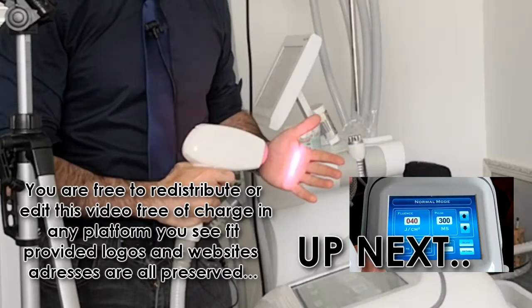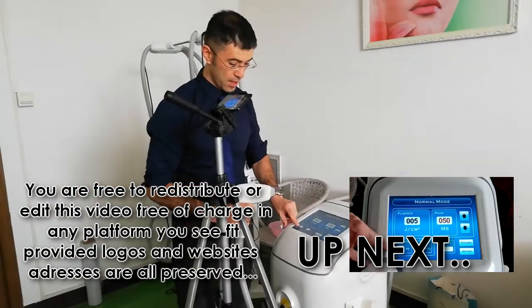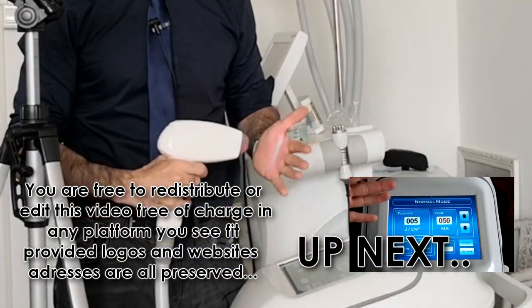At this distance I can feel it. If I go, I cannot dare go even closer because it's really, really powerful. This is why it's only allowing 8 pulses a second. We're going to just try it right now just to show you. And you can see the pulse mode.